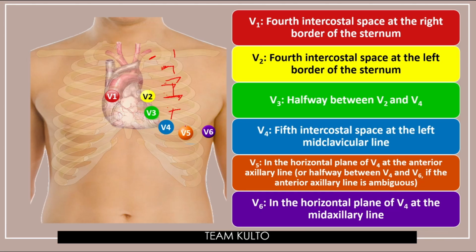V6. Last na to. In the horizontal plane of V4. V4, same line lang sila technically. Same line. At the mid-axillary line. So, ito yung iyong axilla sa gitna. Tapos, ikabit mo yung V6. Ayun na yun. Diba? Mas madali.